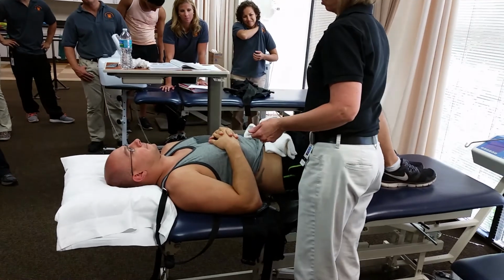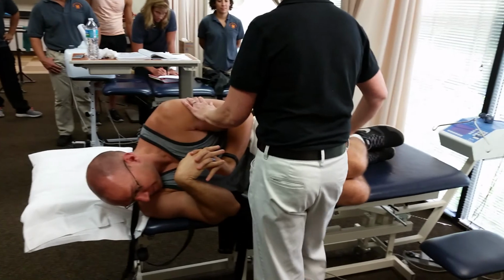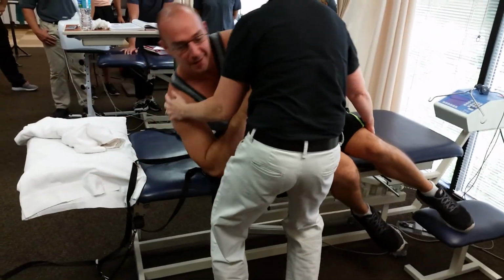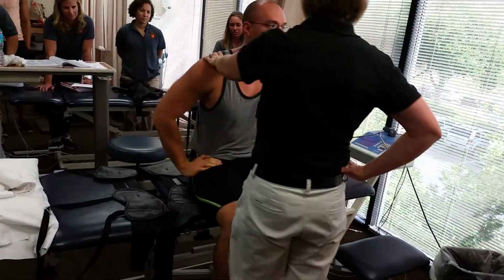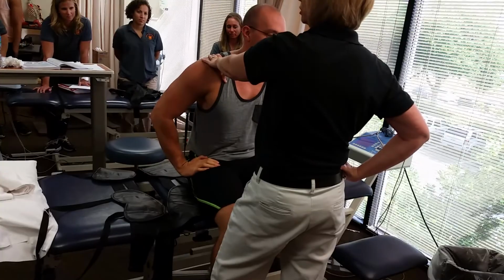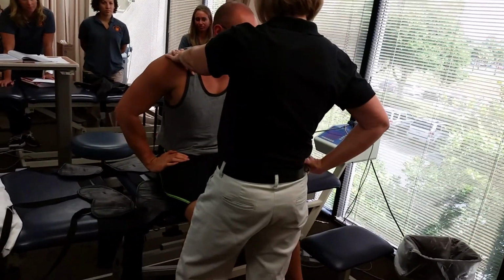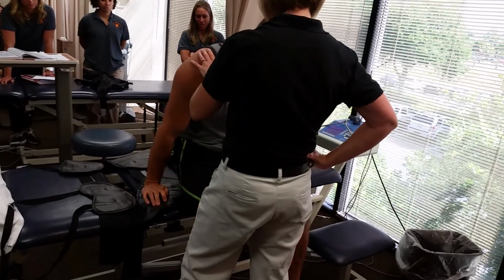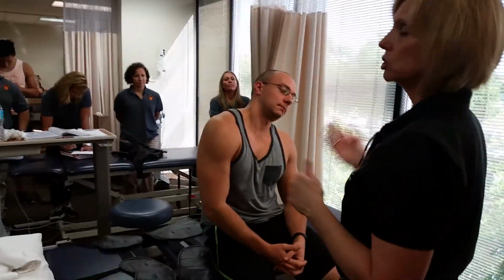All right, and then he's going to roll onto his side like a log. Ooh. Okay, and then bring your legs over the edge. Sit yourself up. Okay, just give him a second. Any dizziness? No. Usually with lumbar there isn't, but sometimes with cervical there can be. So I'd lower the table if I knew where the thing was, or have him scoot forward so your feet are on the floor, because it's easier to catch somebody if your feet are on the floor. Ask him how it felt, change in pain level.